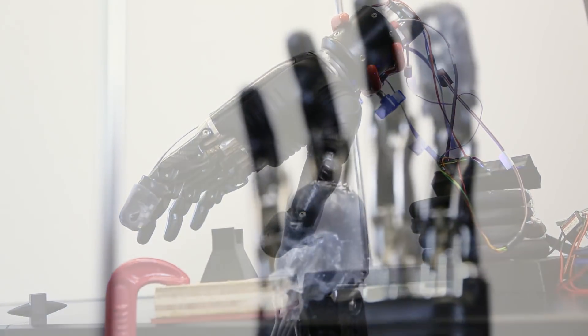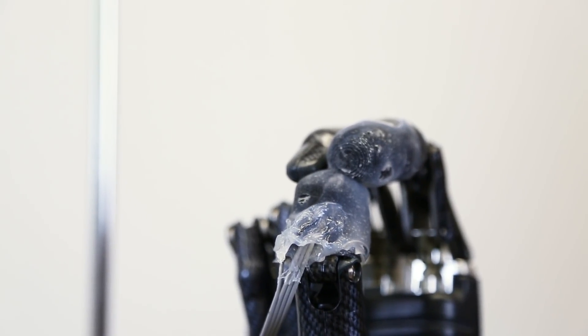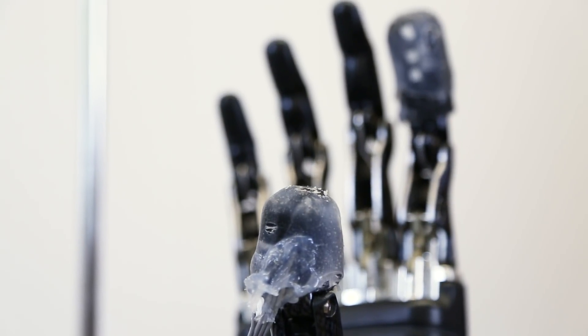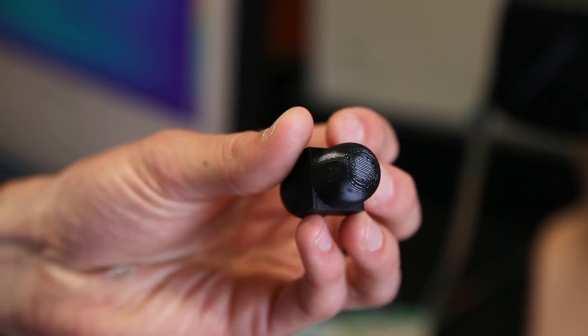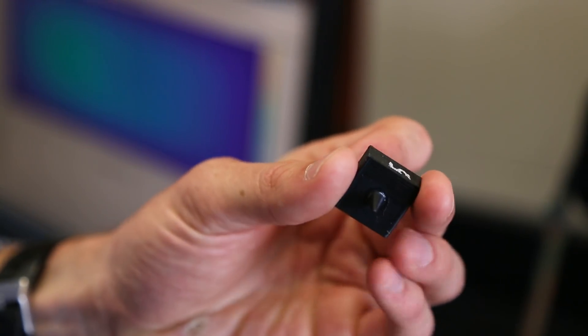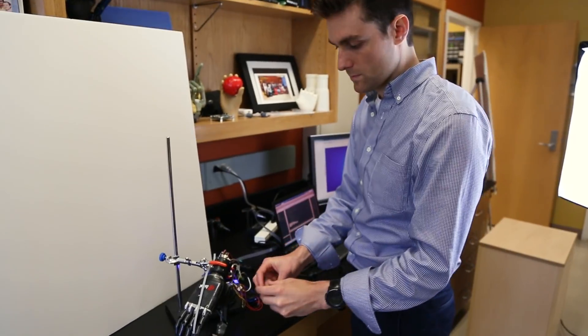We're calling the device we made an e-dermis, an electronic dermis. What's particularly interesting is that we're able to detect an object's curvature, so we can differentiate between something that's nice and rounded versus something that's very sharp and pointy, and that's what lets us differentiate between something that's painful or not.